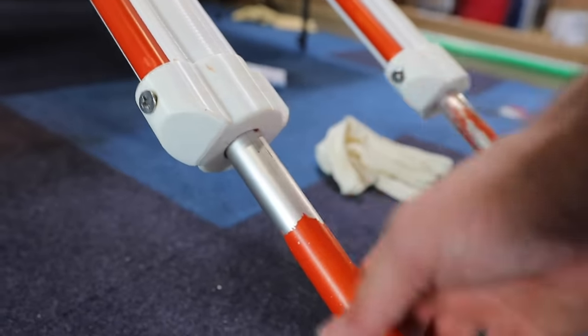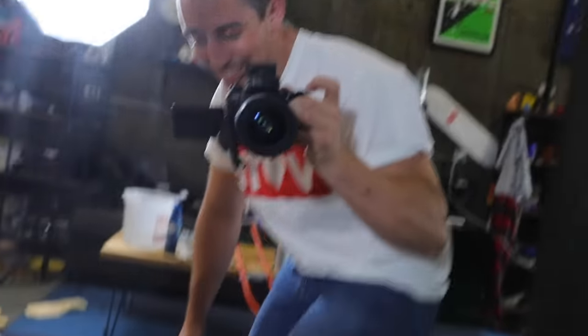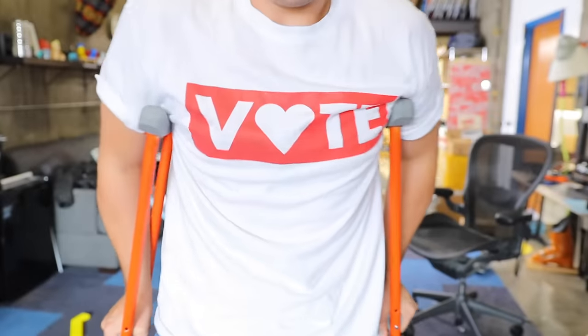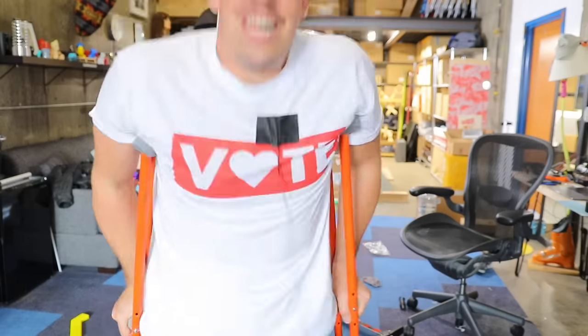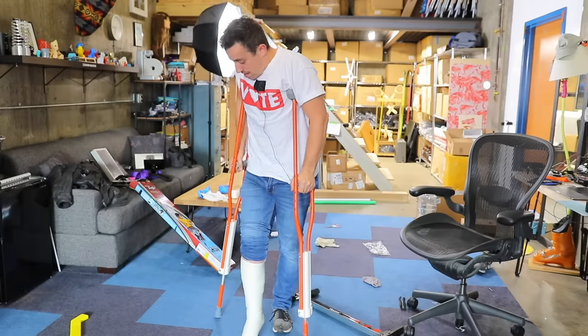I've got the second crutch assembled. The only issue I ran into is I didn't account for a little extra width when making the hole inside the 3D bracket, so when it goes up and down it does scrape off some of the excess paint — but overall it's not bad. There's only one thing left to do before we actually test the pogo crutches in all their glory, and of course that is to cast my leg in a real cast. Just for a little bit of clickbait — I did break my leg at one point, it's just not actually today.